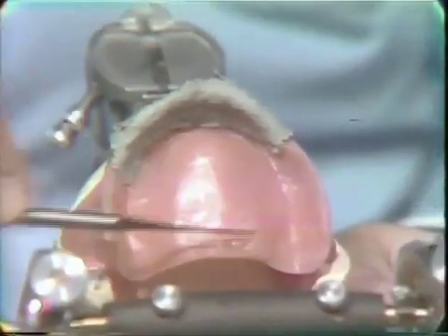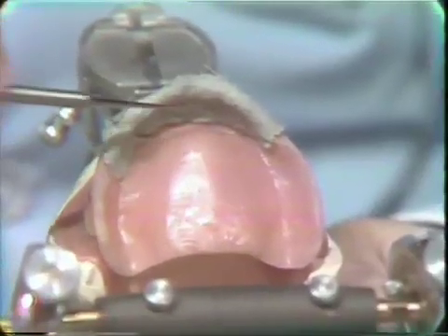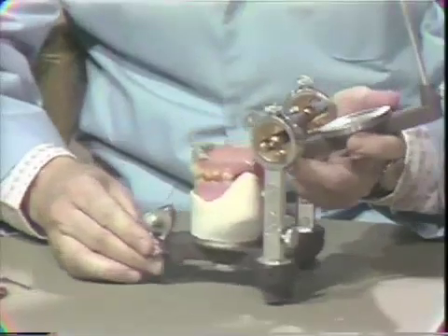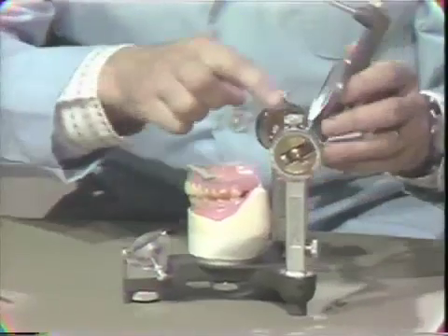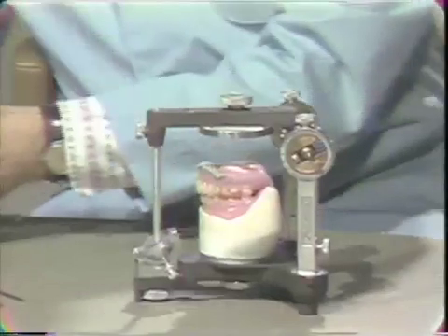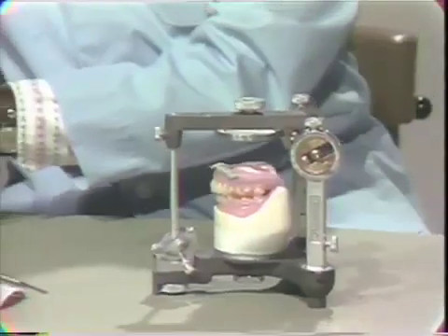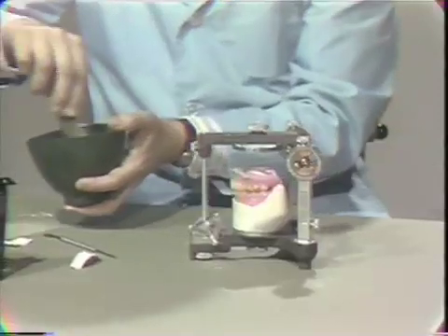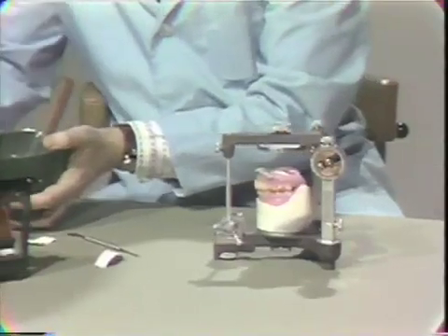You'll notice in this particular case that there are no undercuts from this area back — the only undercut in the case is in the anterior region. So at this point we are ready for the final step and that is to add our plaster. So I'm going to mix up a little plaster and demonstrate this last step and show you what your case should look like prior to beginning the selective grinding technique.